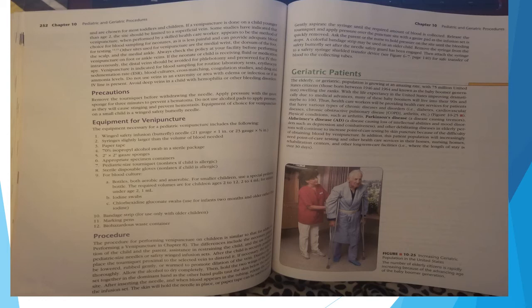Equipment for venipuncture. The equipment necessary for a pediatric venipuncture includes the following: winged safety infusion butterfly needle, 21 gauge by 1 inch or 23 gauge by 3/4 inch. Syringes slightly larger than the volume of blood needed. Paper tape. 70% isopropyl alcohol swab in sterile package. 2x2 gauze. Appropriate specimen containers. Pediatric size tourniquet, non-latex if the child is allergic. Sterile disposable gloves, non-latex if the child is allergic.